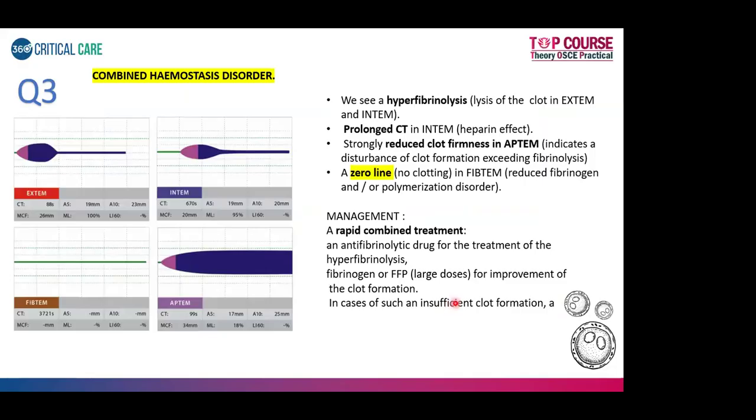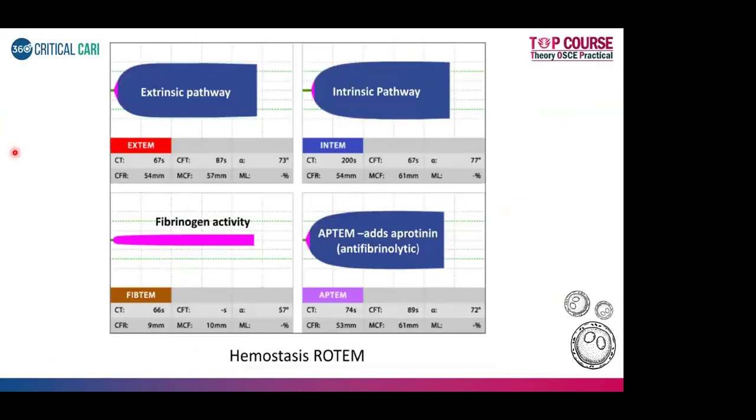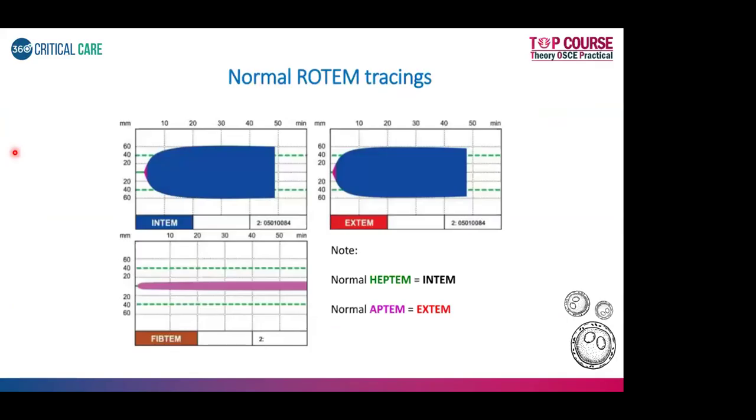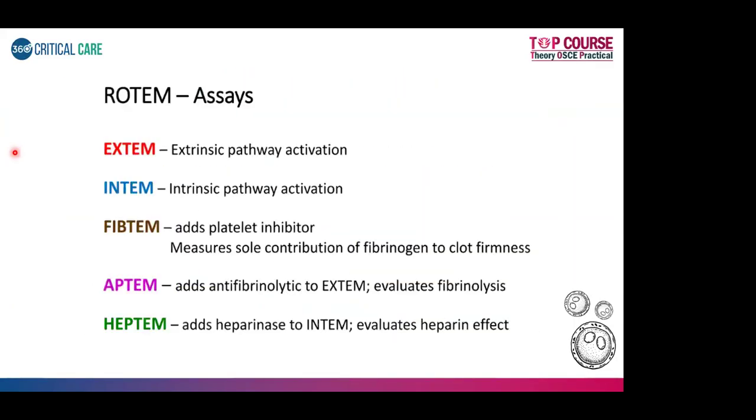What will you see? Hyperfibrinolysis. "Sir, maximum lysis, ML. HEPTEM, sir." EXTEM. Yes. So first you have to see the EXTEM, and then you have to go to your APTEM. If you can remember this slide, it is good enough. So whenever you have extrinsic pathway issues, look at EXTEM.